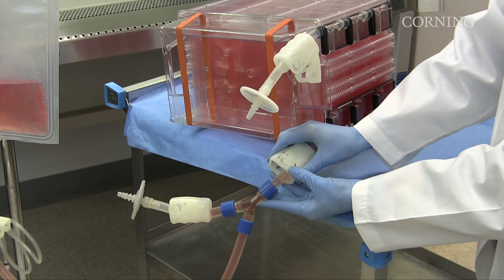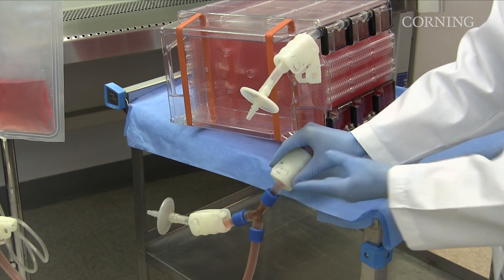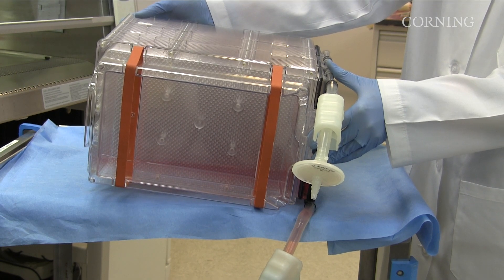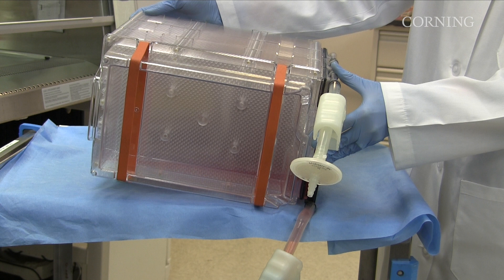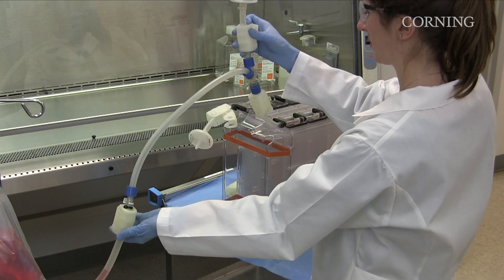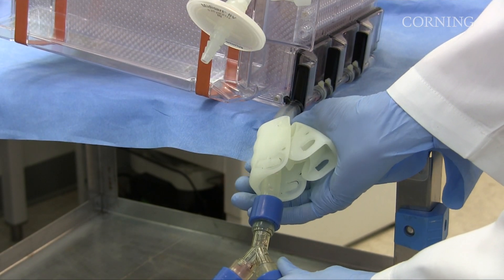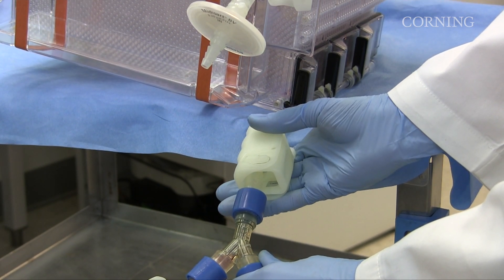If liquid drains too quickly, a vacuum will be created inside the vessel that can damage the cells and the vessel. During the empty procedure, elevate the back end of the Hyperstack vessel using a clamp or small object to about a 10 degree angle to ensure the vessel drains completely. After the vessel and liquid handling tubing are empty, turn the vessel to the equilibration position and lift the tubing to chase the media. Close both the clamp on the liquid handling tube line and the clamp on the collection vessel tubing. The procedure is now complete.